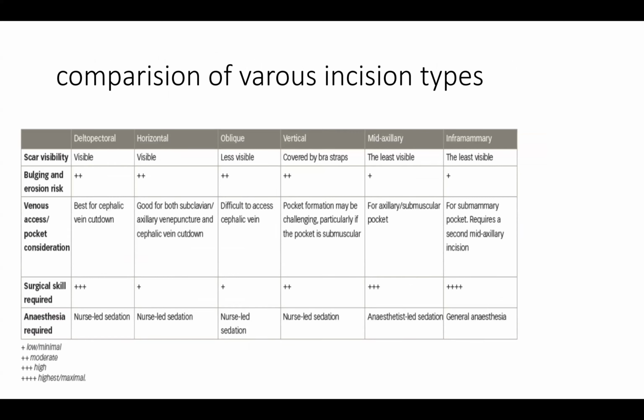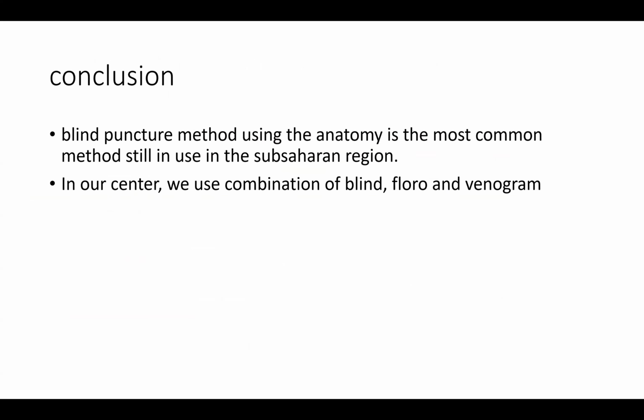Okay. So looking at the various incisions, the commonest incision we usually do around here, AJ, is our transverse incision, but you have all manner of incisions that are described in the book. So any incision that you are used to, please stay with it. But most times for a subclavian pocket, a transverse incision is usually what is recommended.